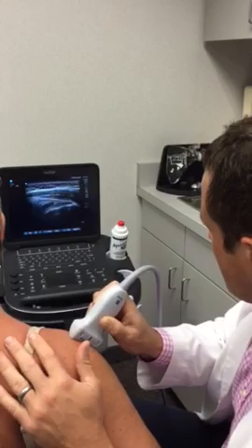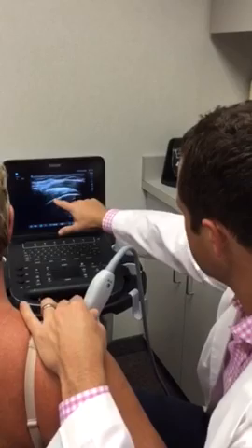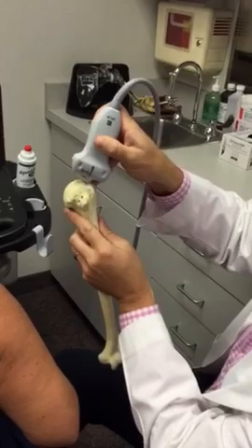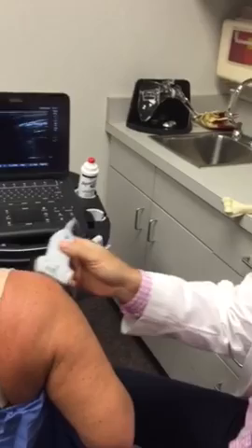I like to turn my hand a little bit to see the rotator cuff flat across the screen. There's the infraspinatus going right back there — no tears at all. Looking at the bone model, you have to angle your hand as you come off the backside.